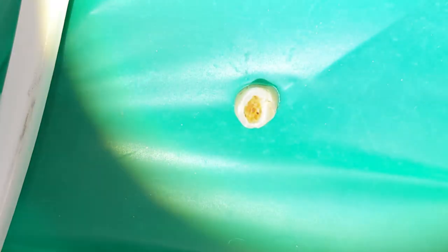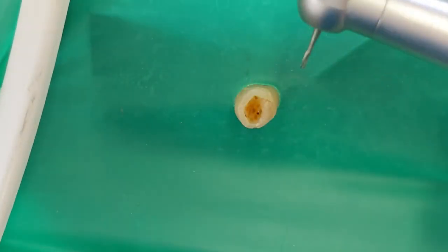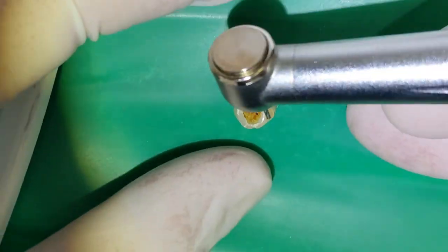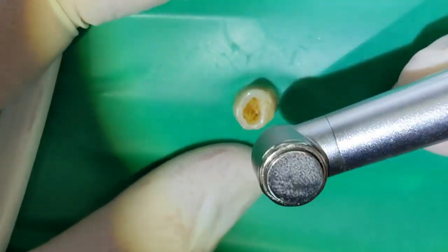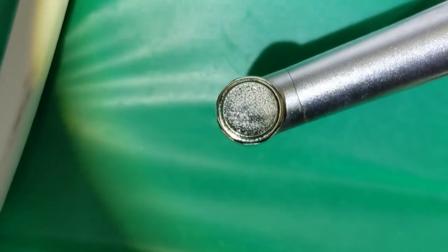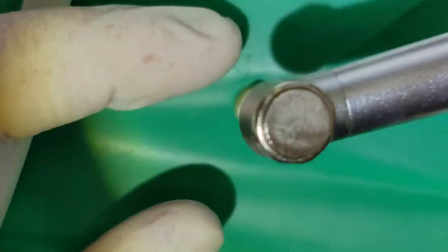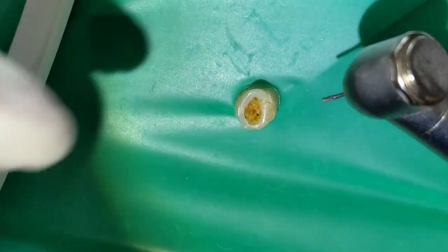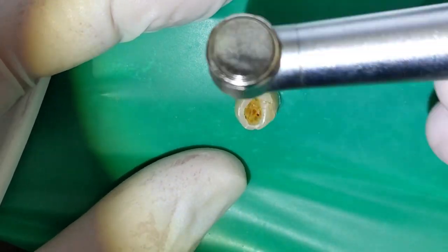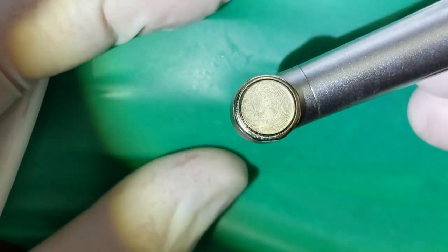So the first step is to get into the nerve space. For the access, I'm just going to use a high-speed drill. Since this tooth is so worn down, I can just go straight through the worn area. If this tooth was a solid virgin tooth, I'd have to come in from the back side of it. So here we go.